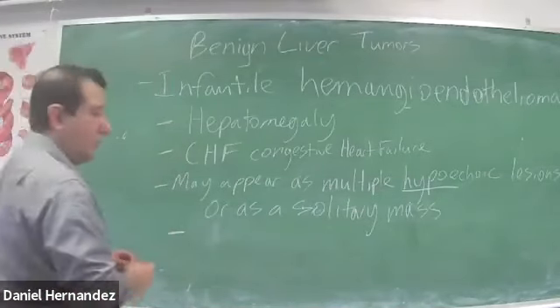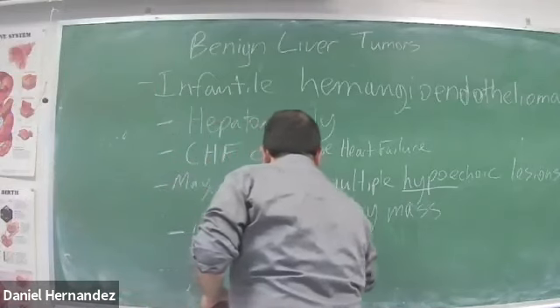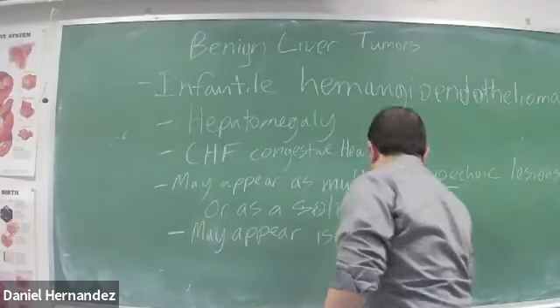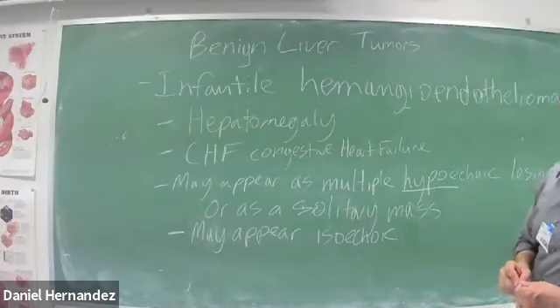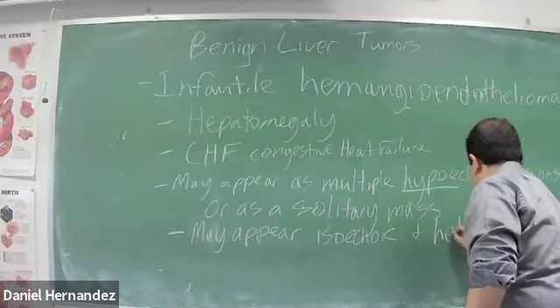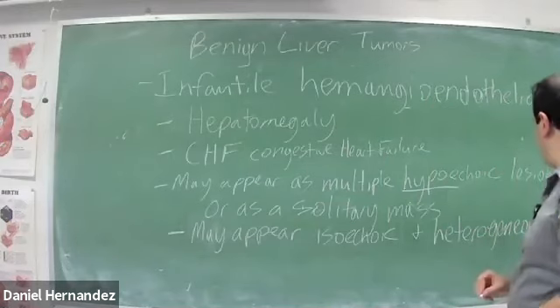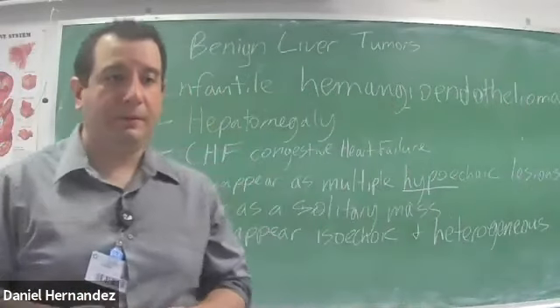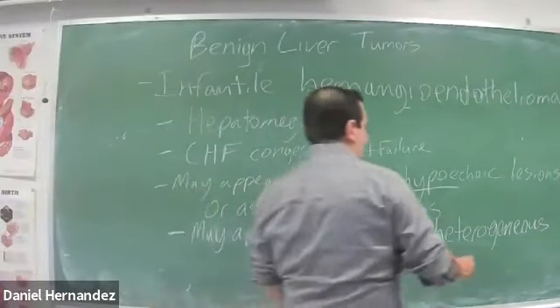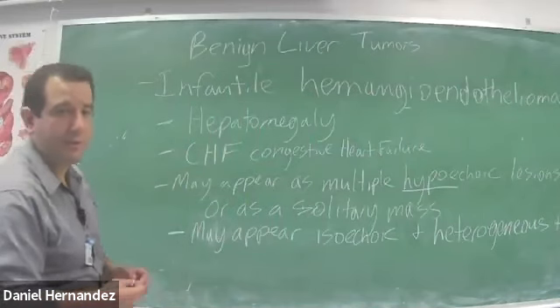They may also appear more isoechoic and heterogeneous, and may contain cystic components.